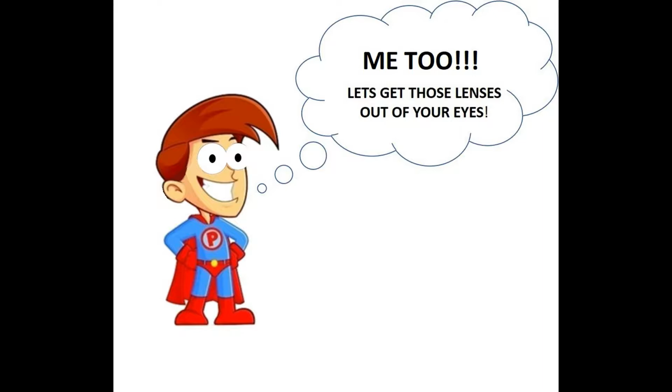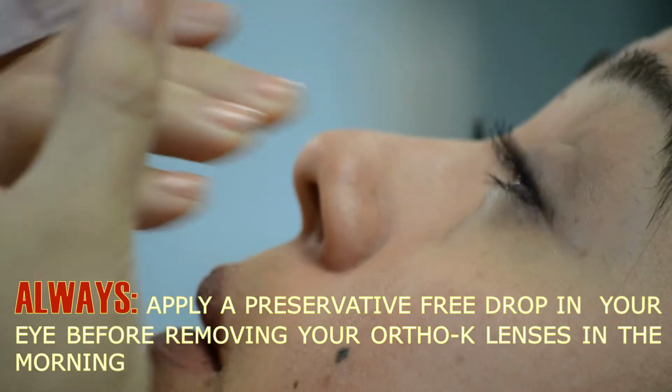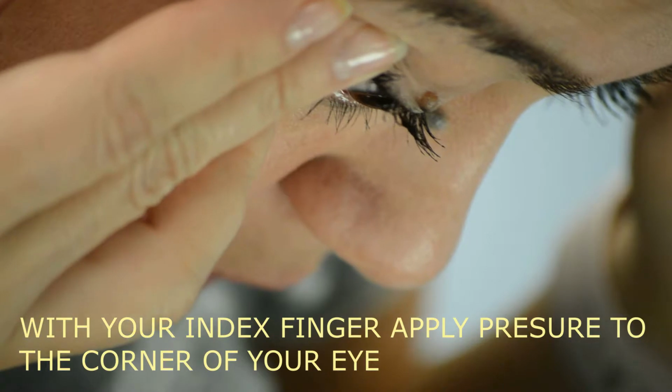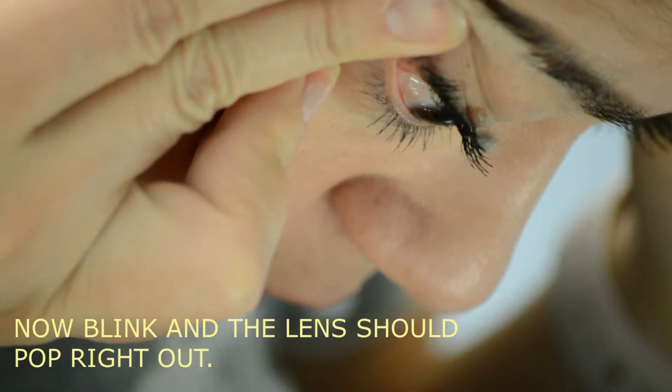Now let me show you how easy it is to remove your lenses. Ready? Let's get those lenses out. First, before you remove your lenses, apply a drop of preservative-free solution in your eyes to help loosen your lenses. Now with your index finger, apply pressure to the corner of your eye. Now pull back and up toward the ear. Blink and the lens should pop right out.